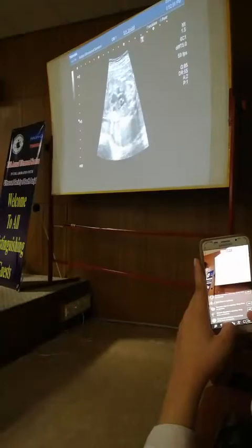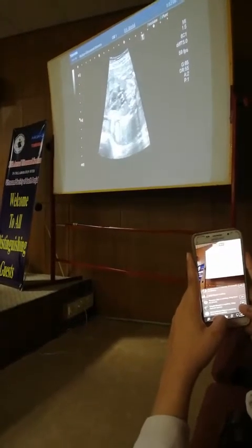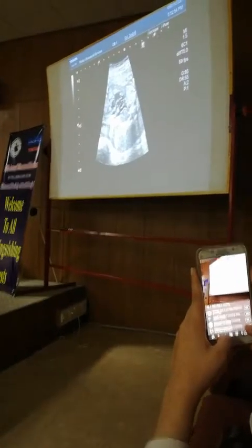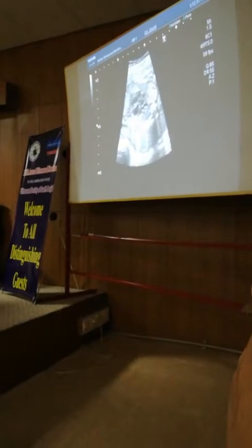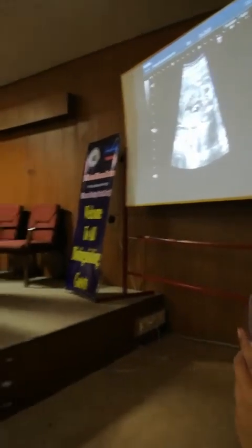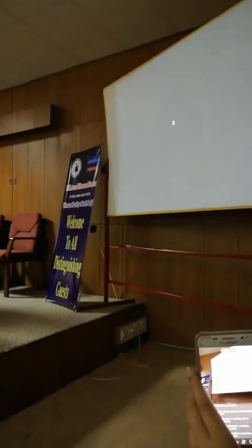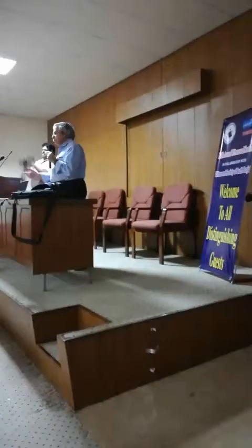You saw that? This aorta arises from the left ventricle, goes to the right and then to the left. Alright? And you can see the aortic cusp inside. Is it clear? This is something that you should be able to get in many of your patients.